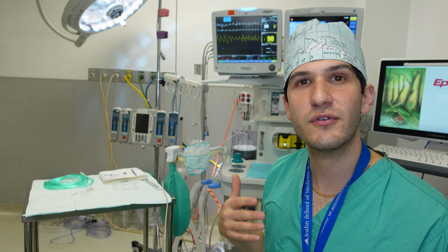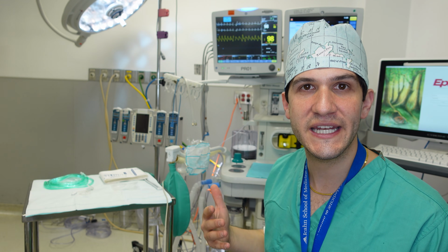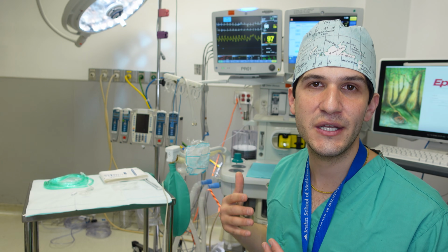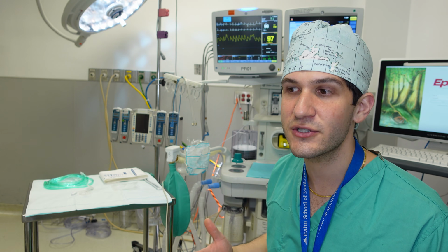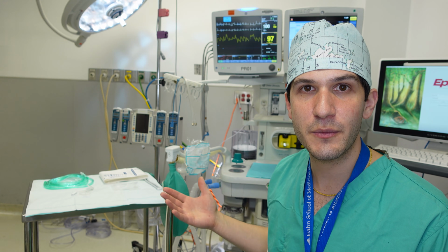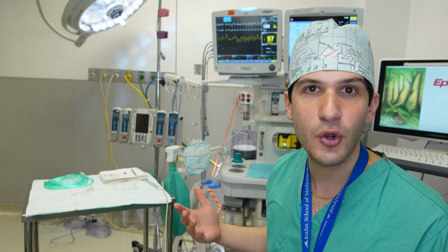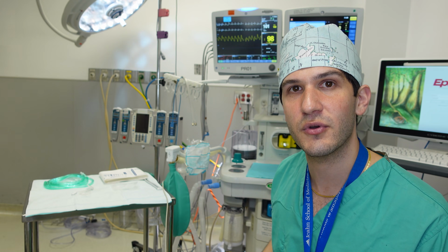I just want to point out several important aspects of pulse oximetry. One being that this monitor actually gives me an indication of how good of a signal quality I have, which can be decreased by any sorts of illness like peripheral vascular disease, or even if a patient's just really cold, it can be difficult for the monitor to pick up a good quality signal. And so that signal is indicated here on the monitor with either 0, 1, 2, or 3 stars that are next to the pulse oximeter.